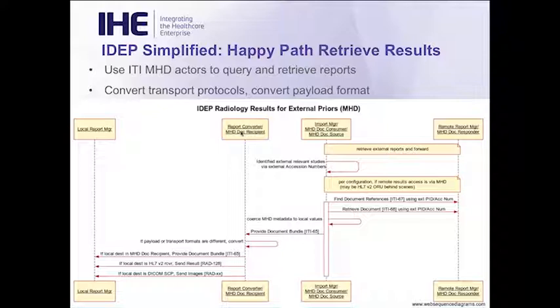As an example, we said DICOM secondary captures cannot be converted to an HL7 CDA level 3 document because it's not possible to do it. The information's not there. Oh, I'm just talking about MHD mapping to MHD submission. I think we'll probably have to do that. Okay. Well, we can get out of the weeds so you can continue.